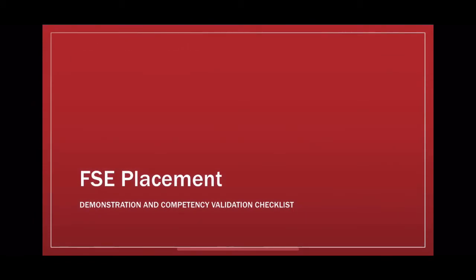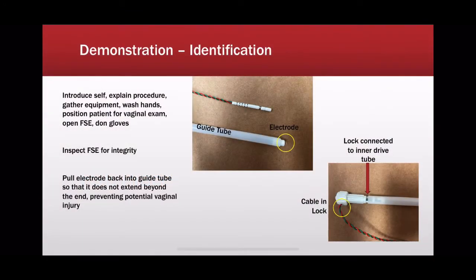Now we're going to go through step by step of a FSE placement. I'm going to go over the competency validation, and then there's a YouTube video where you can actually watch the demonstration. First, we want to identify our patient, the procedure, and our equipment.